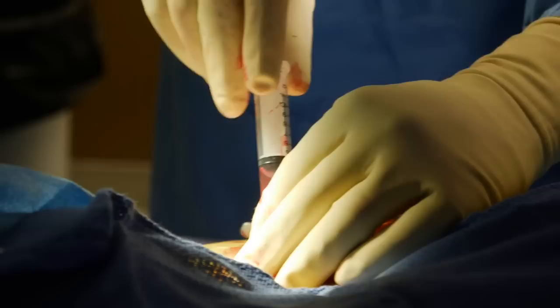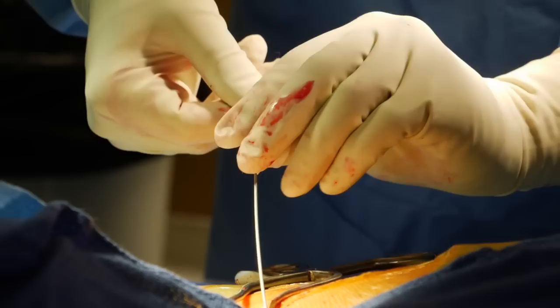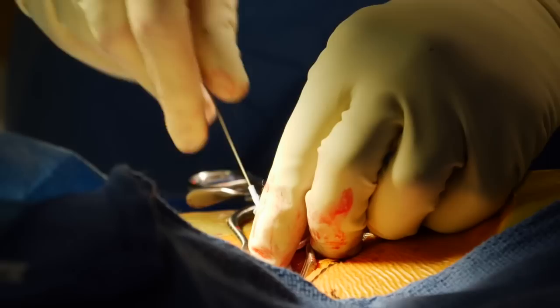This is a delicate step. The syringe comes off and then through that needle we pass a guide wire through the insertion needle, through the vein, down into the heart. This is the track over which we'll implant the leads. We then exchange that needle for a series of sheaths. Using a micropuncture kit, the first sheath is small. We remove that and the guide wire, then through that first small sheath we implant the larger guide wire which will support the sheath used to implant the pacing leads.